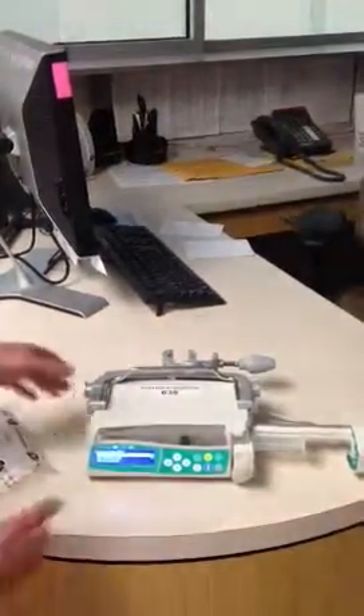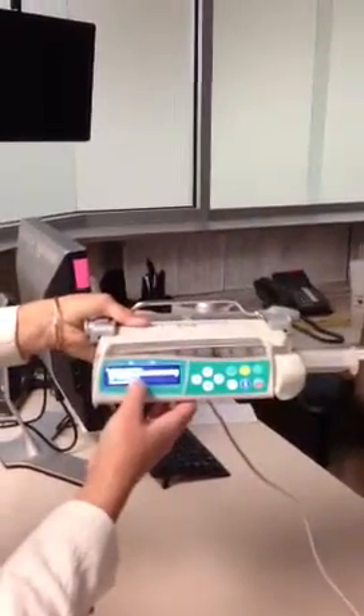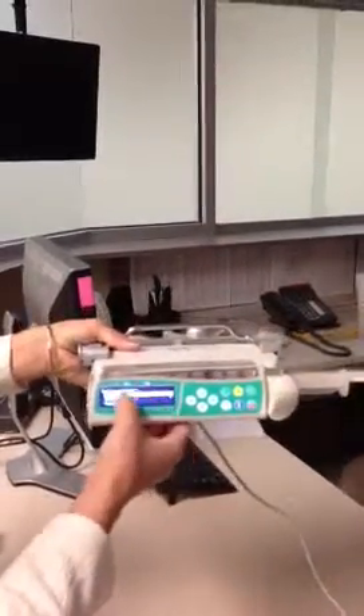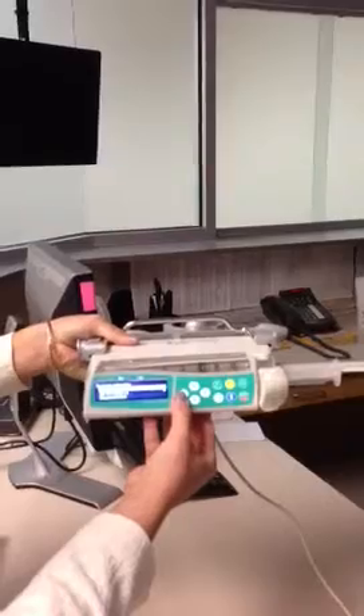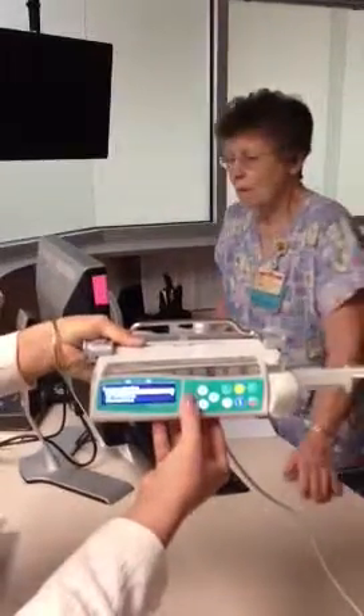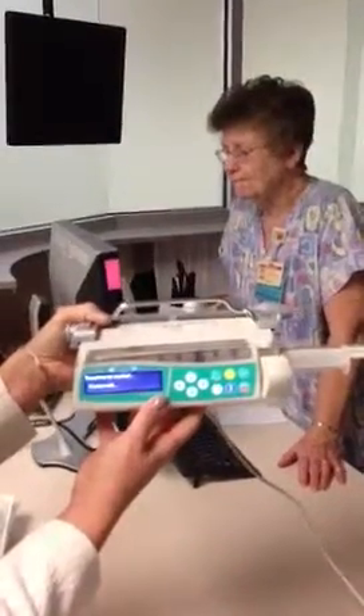The next thing the pump will ask is that it has auto-detected a Monoject 60 cc syringe, which is highlighted. Just like a cell phone or an iPod, you're going to either left arrow or press OK. You hit the corresponding arrow that's highlighted, or you just select that it is that 60 cc syringe. Your automated drive arm is going to come into place.